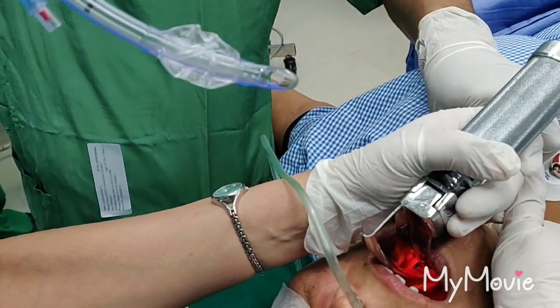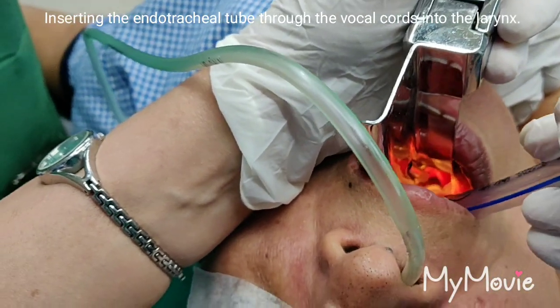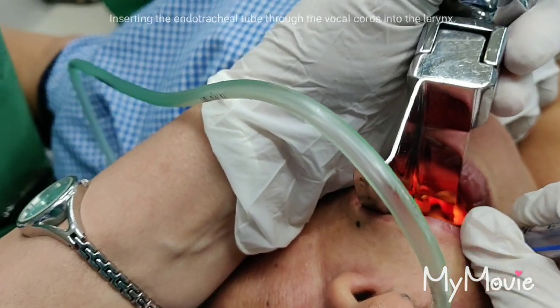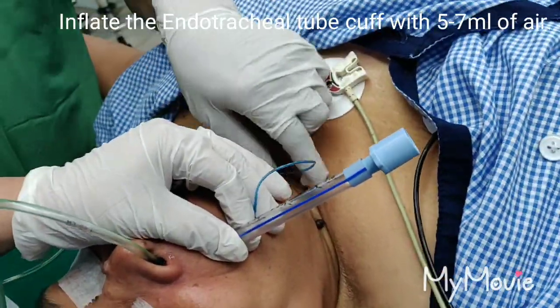Some pressure. Yes, I'll go. Can you push also? Can you see the cords? Keep it there. Tube going inside. Black mark just beyond the cord. I'll feel it. Thank you. Please inflate the cuff. That was the intubation.